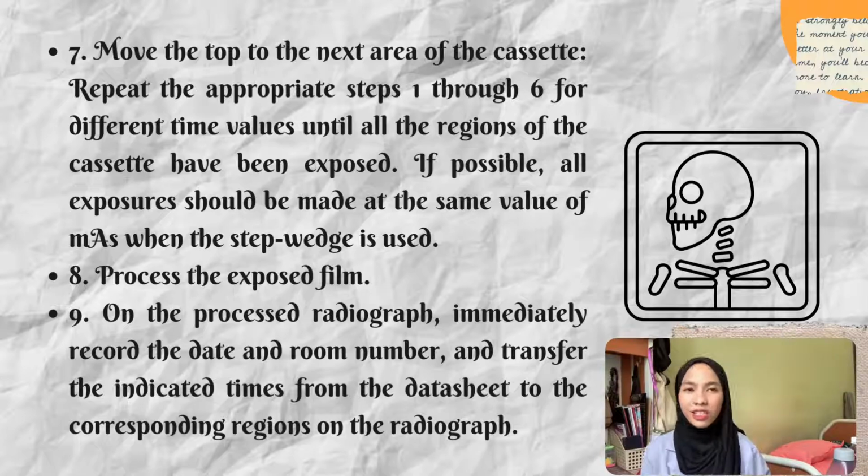That's all on this QC method. I hope after this you will be clearer on what you need to do to make sure the exposure time is accurate. Then after you have done your QC method, you can make the calculation that has been explained in the standard part.